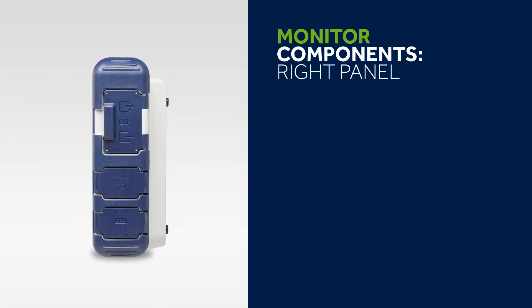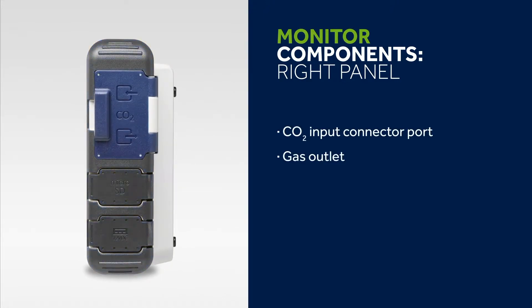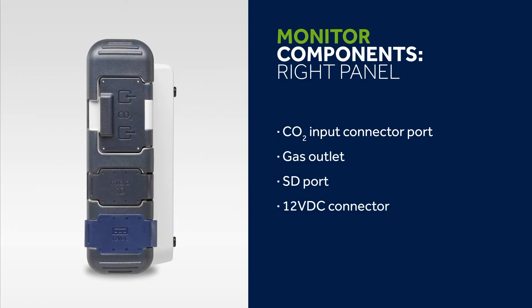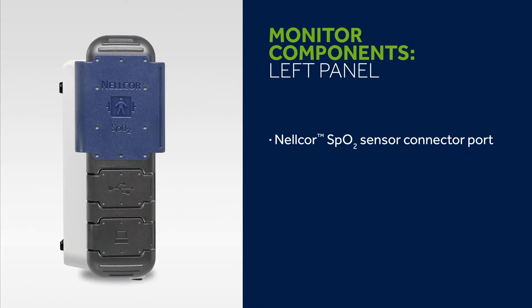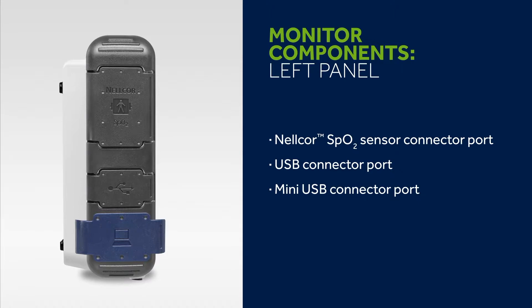On the monitor's right panel you'll find connector ports for the Microstream CO2 sampling line, gas outlet, SD card and 12V DC connector for the AC adapter. The left panel has connector ports for the Nelcor Pulse Oximetry Sensor, USB flash drive and mini USB for technician access.